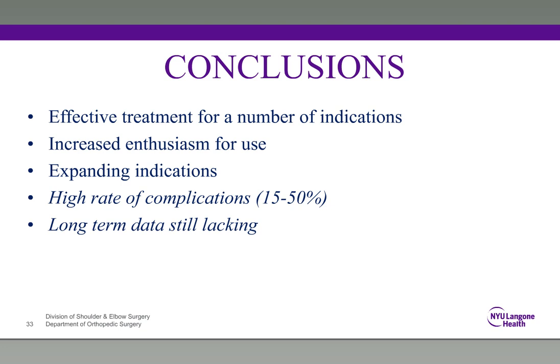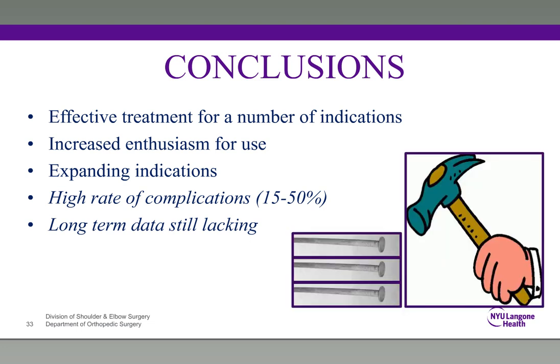In addition to that, we need to also remind ourselves that the long-term data for reverse replacement is still lacking. We've been using this in the United States really only for the past 14 to 15 years. It doesn't have the 20 to 30-year data that we see for other replacement systems. So an analogy I'd like to present is something that others have told me, which is that when you have a good hammer, everything's going to look like a nail. And I just wish that we would progress a little slowly and really try to go by the available literature before jumping on the bandwagon. Thank you very much.